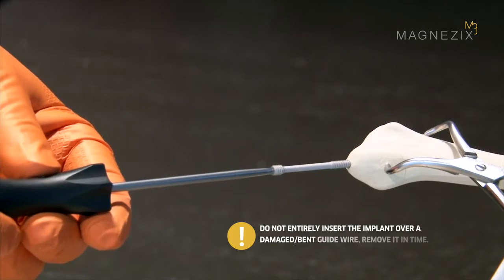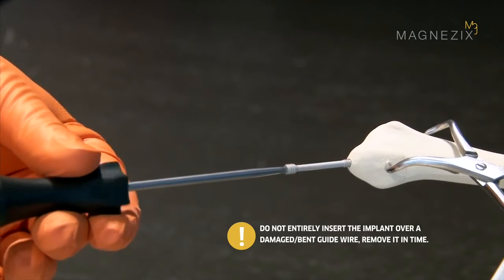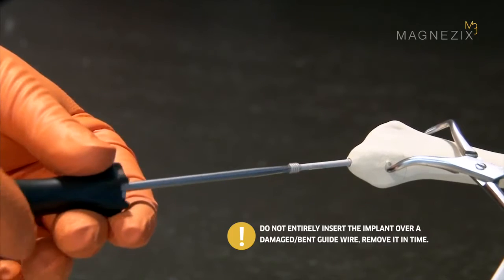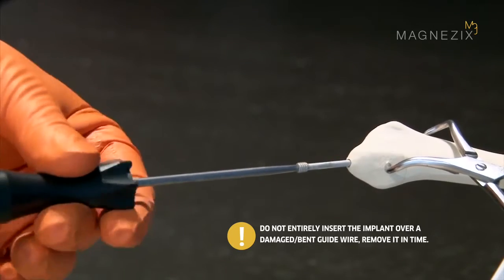Make sure that the guide wire has not been damaged in the previous steps. If the guide wire has been damaged, it may not be possible to fully tighten the screw. In this case, the guide wire must be removed before the screw has been completely inserted.